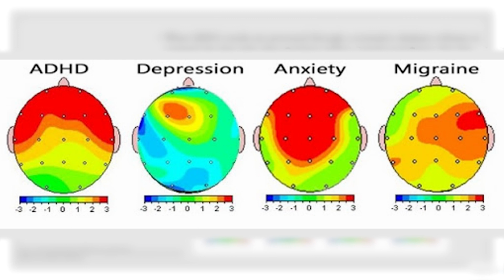Here, it doesn't tell me whether it's in the alpha frequency, delta frequency, theta frequency, or beta frequency. It doesn't tell me anything. It tells me there's a red spot in the front, and there's too much of something in the front. But that's it. So again, be very careful with this, because we do not see these types of things in the brain. We see activity that corresponds or could correspond to certain symptoms. So keep that in mind. It is very important.